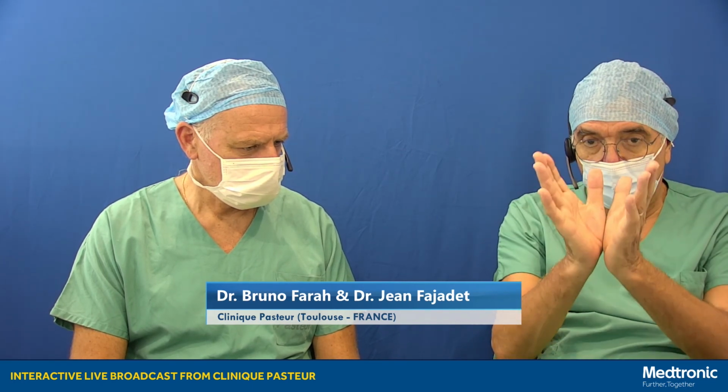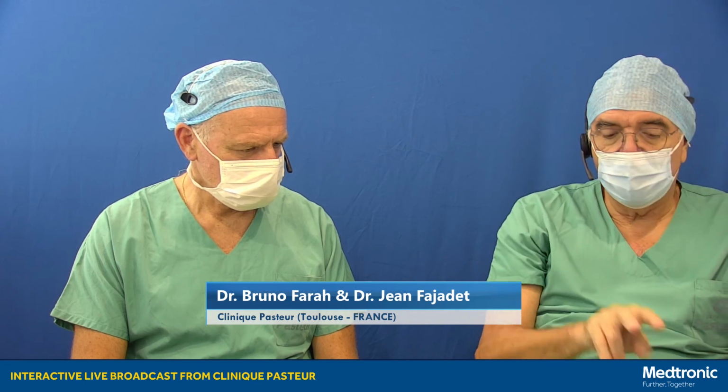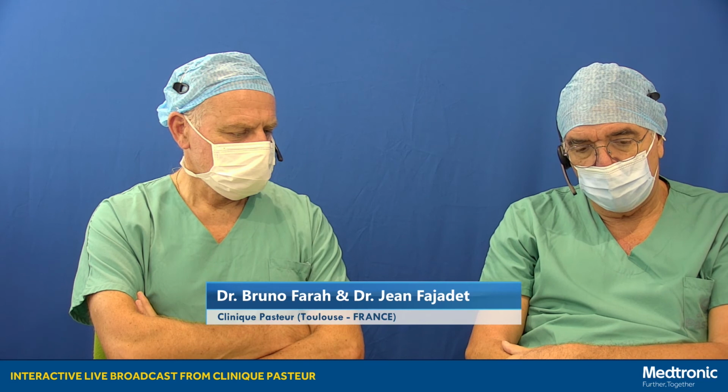And then concerning the procedure, there were, as you said at the opening of this webinar, really two parts. The first was the treatment of a bifurcation lesion, which was a severe lesion on the proximal LAD, including a large diagonal branch.